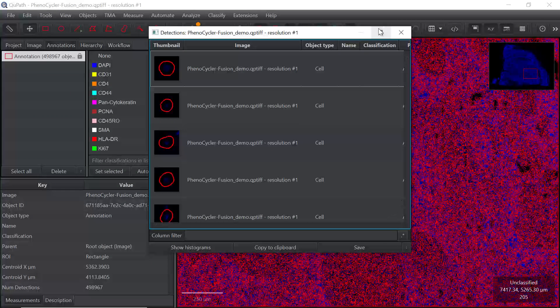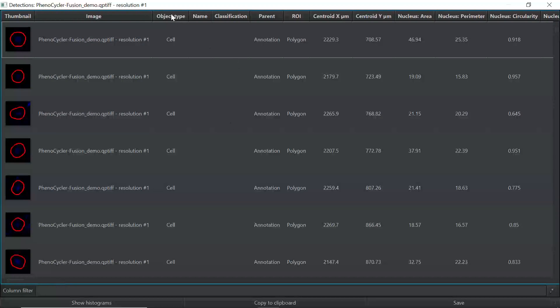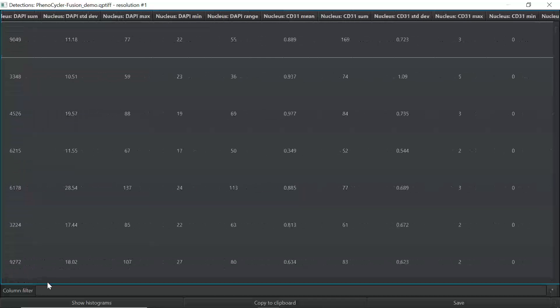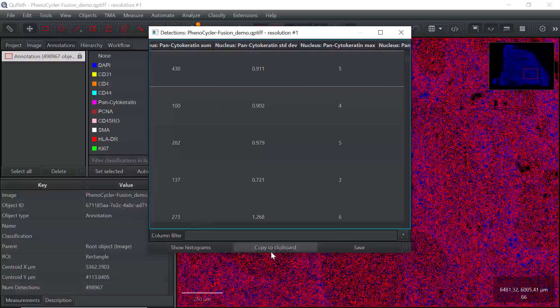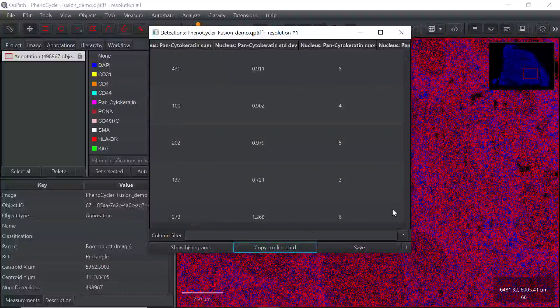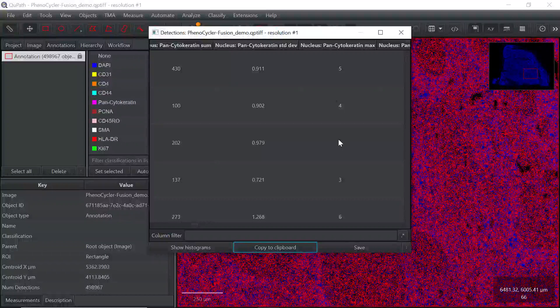Now we have the data. The object type is cells. We have cell position data — centroid Y and X — along with nuclei area and nuclei perimeter for each cell. Scrolling down shows additional measurements for each channel, such as the DAPI channel and the CD31 staining channel. In total we have 16 channels. You can copy all the data to the clipboard, then open an Excel file and paste the data to get all the information for spatial dataset analysis.